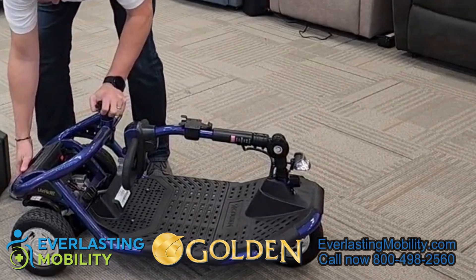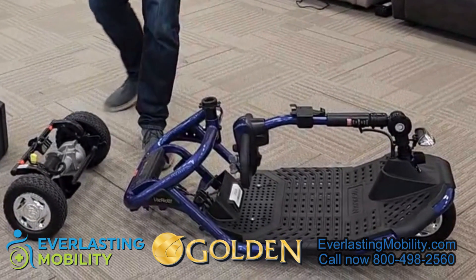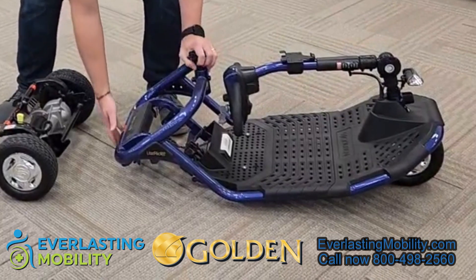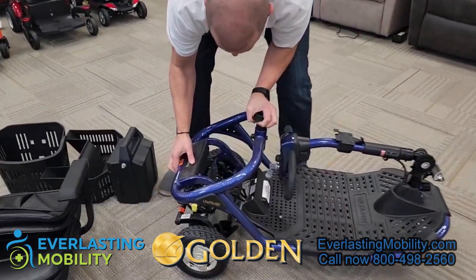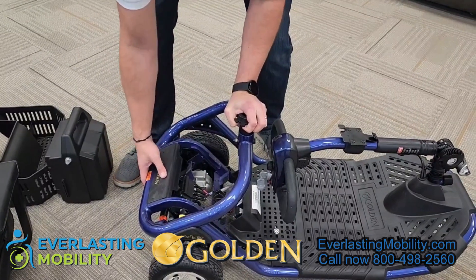At this point, press the lever on the back to release the front half portion and separate it from the rear axle. When broken down, the heaviest piece will weigh about the same as a compact mobility scooter's heaviest piece. There's a lot of thought put into the design of this scooter.